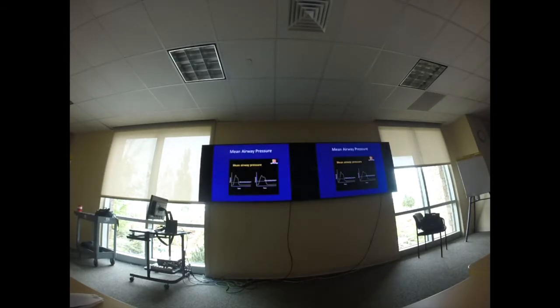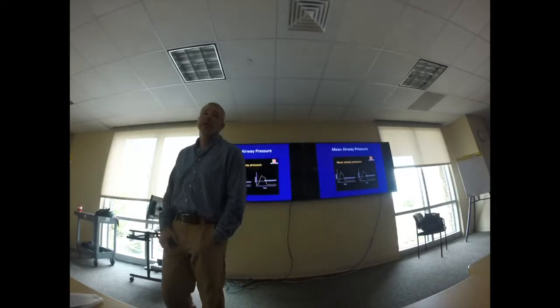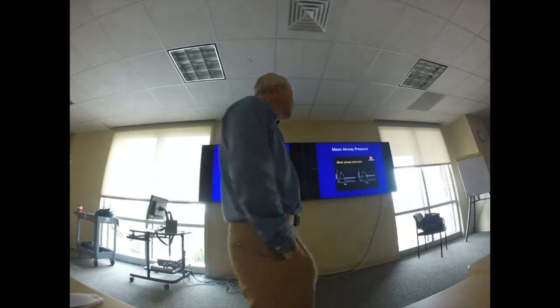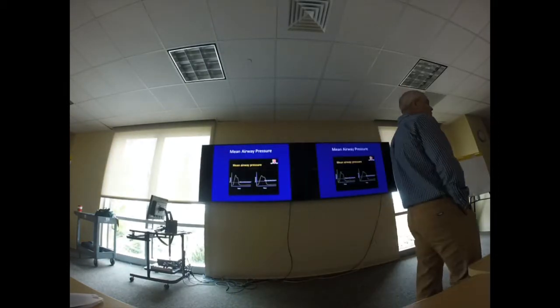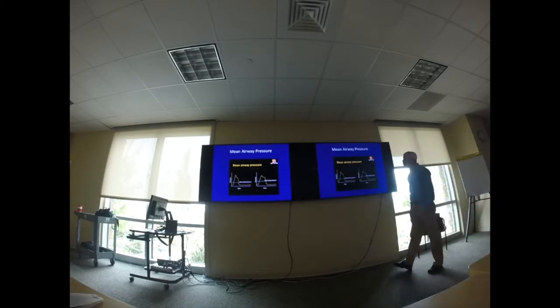My mean airway pressure is just an average, right? So it's the average, and you guys can see here where they cut it in half right there. So it's the average pressure applied during inhalation and exhalation during the ventilatory effort right there. And again, normal is somewhere between 6 and 11, 8, somewhere right around in there. And it's just averaging my pressure.